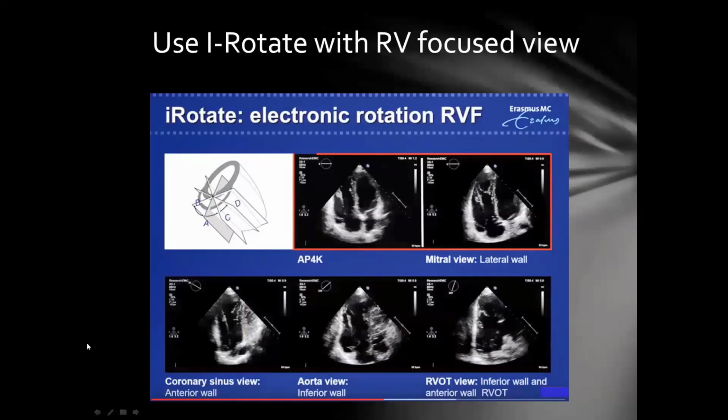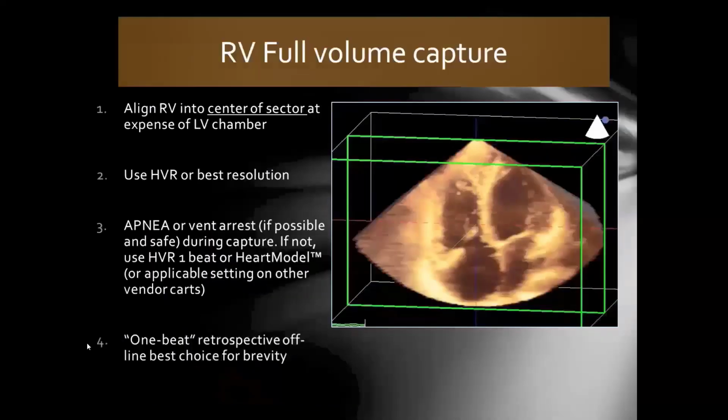Okay, so this is the coronary sinus view there, right here on the screen. So this is a tool, I can't push it enough. If you want to do a rapid exam at the bedside and get a lot of information rather than just a couple of pictures, and it's okay by your institutional policy and you're okay as a sonographer, use it.